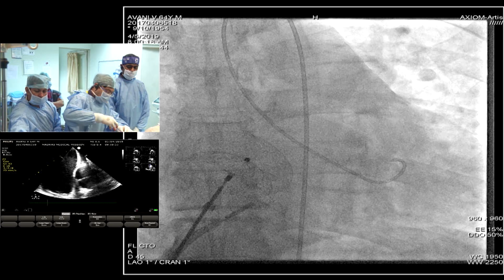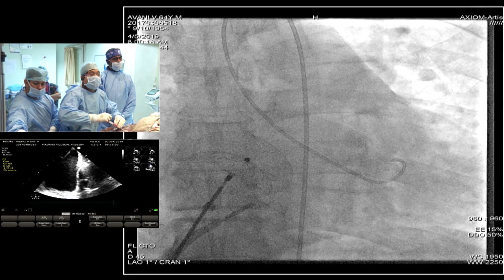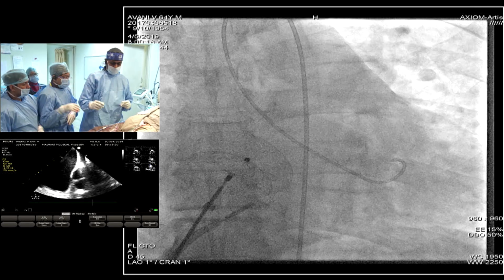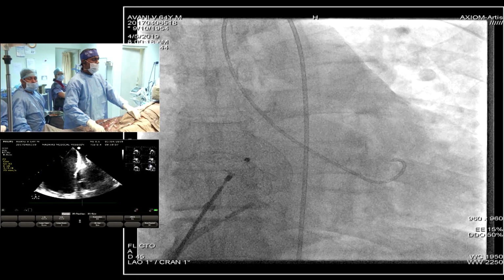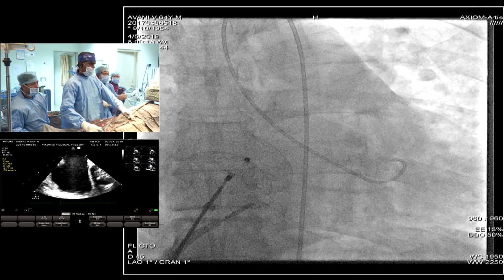So apart from this, in a standard atrial septal defect, we hardly resort to balloon sizing. What has been the practice in Auckland, Cambridge, and all your places, Claire? So we routinely balloon size. Yeah, we do it. I'm interested. I'll pass this along, but I'm quite interested in what you're going to learn from this EDP measurement. I'm not sure about that.